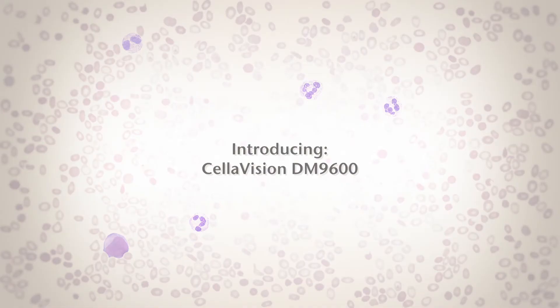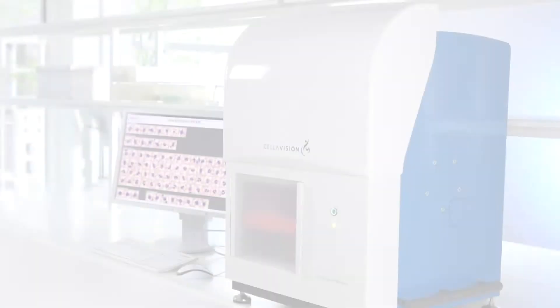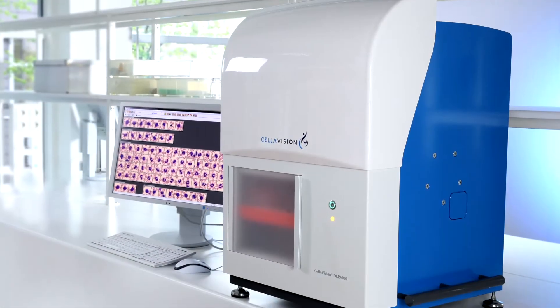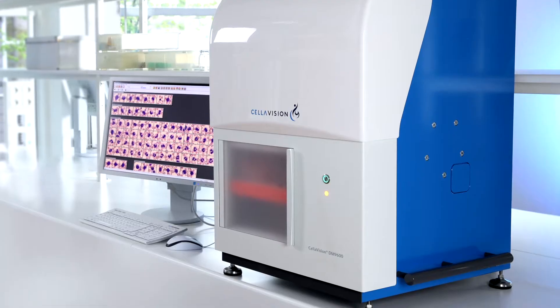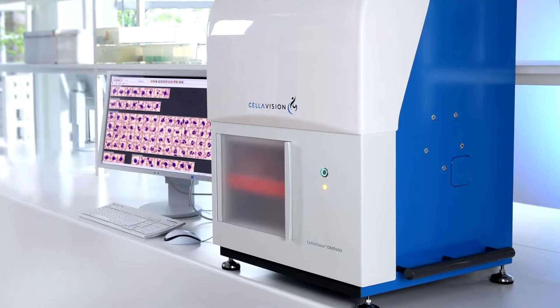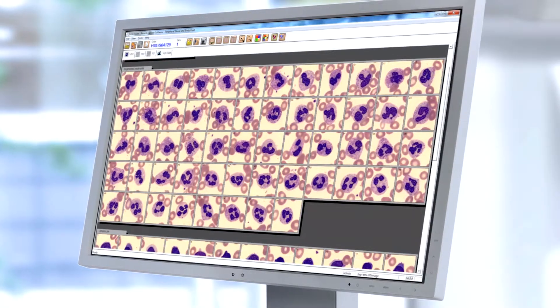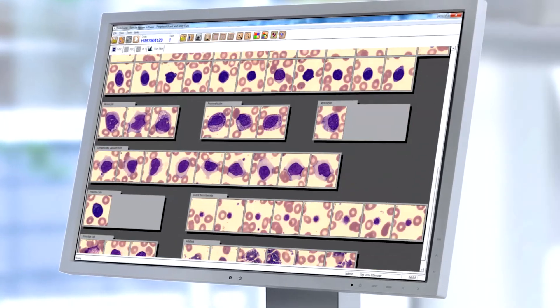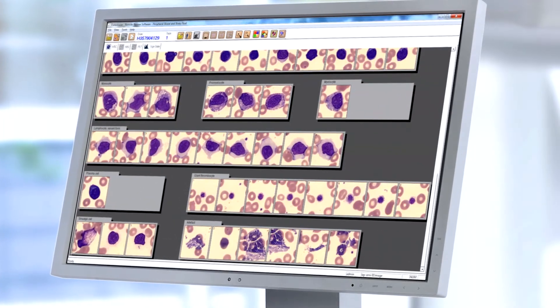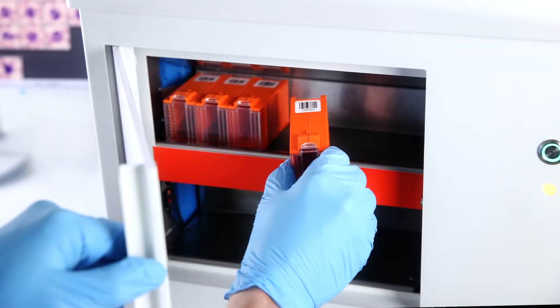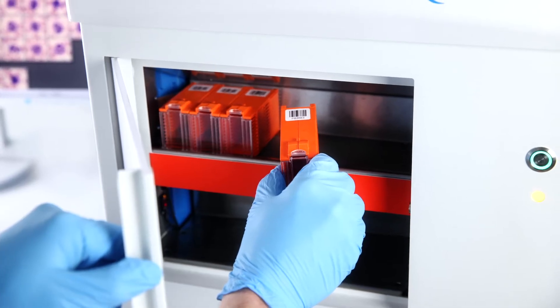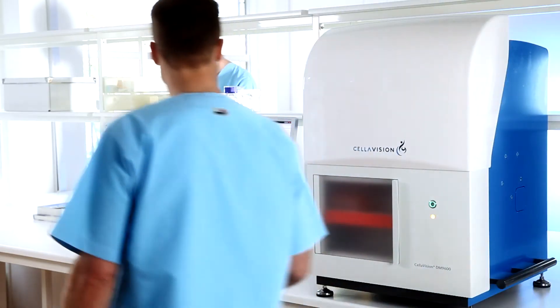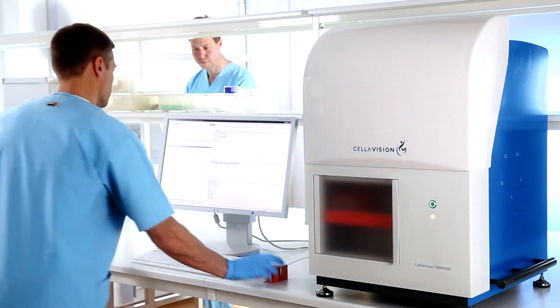The CellaVision DM9600 automates and simplifies the process of performing blood and body fluid differentials, filling one of the remaining automation gaps in routine hematology testing. When implemented together with supporting applications and software, the DM9600 becomes the engine of an automated and digital workflow for cell morphology, enabling you to work smarter and perform better.